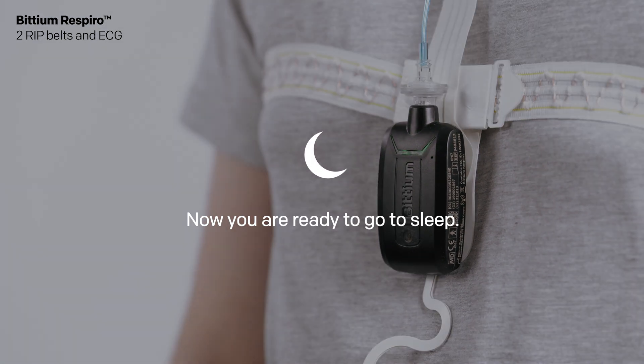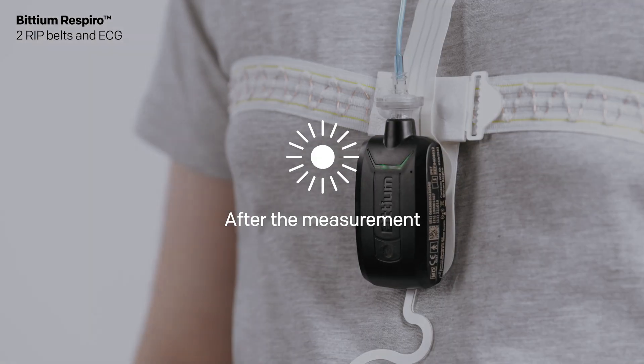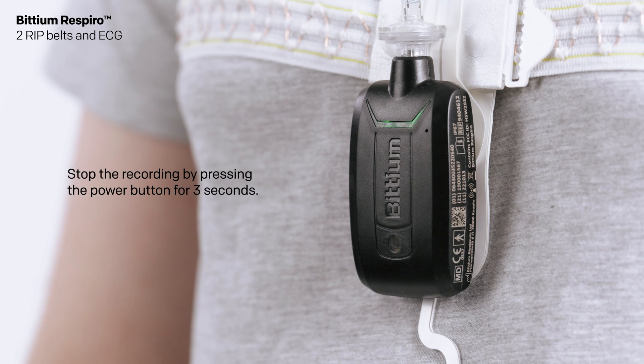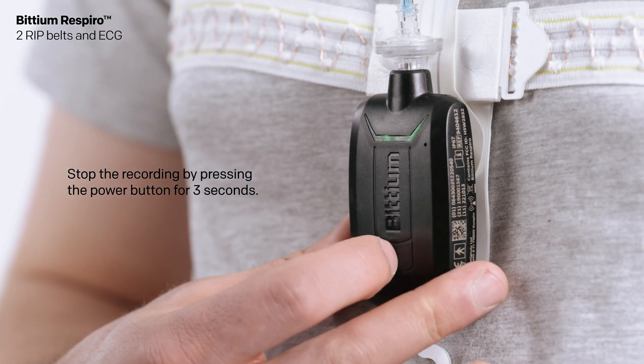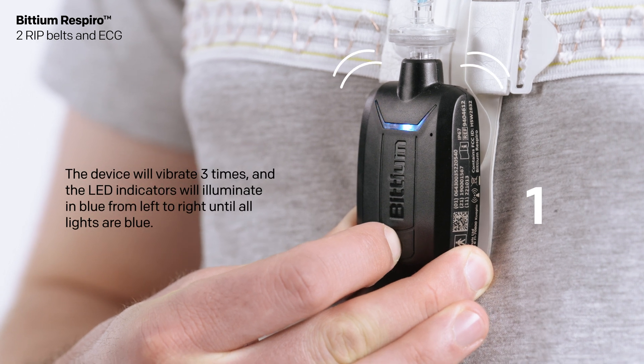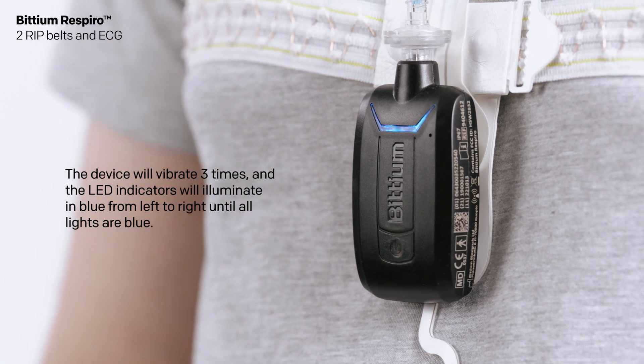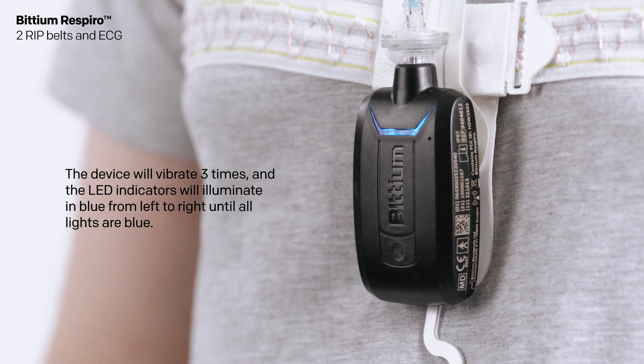Now you are ready to go to sleep. After the measurement, stop the recording by pressing the power button for three seconds. The device will vibrate three times and the LED indicators will illuminate in blue from left to right until all lights are blue.